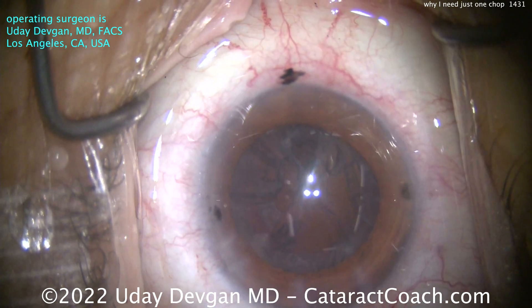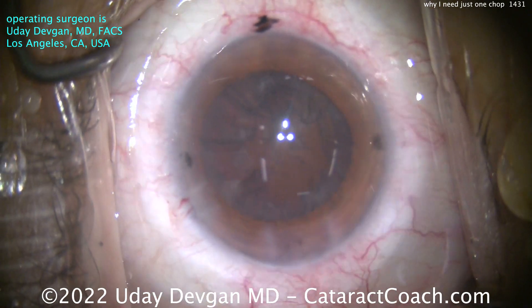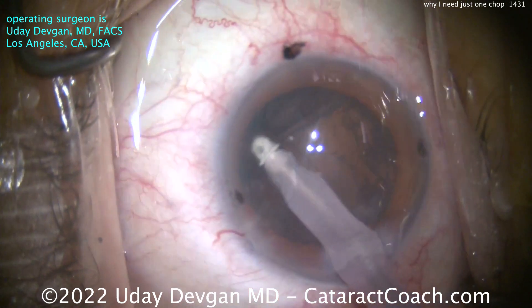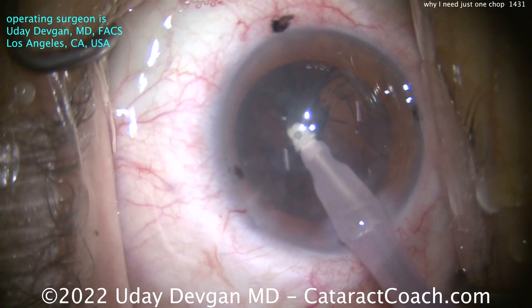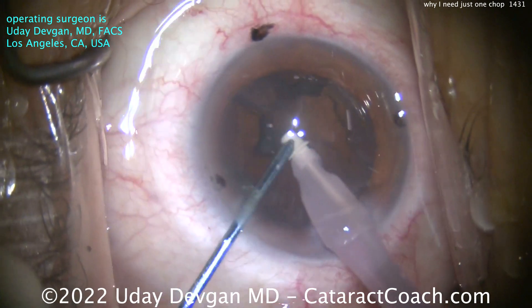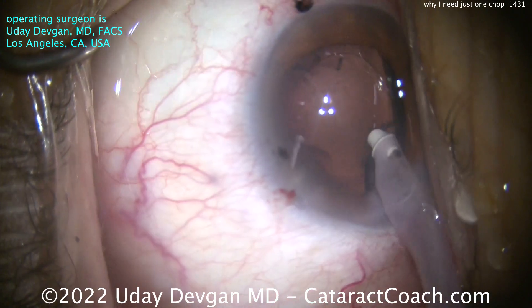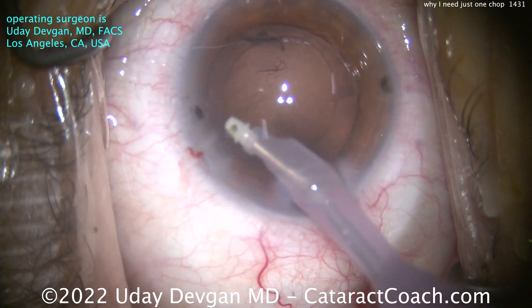The nucleus is out and we're done. So that's the trick behind it: 2-to-3-plus NS — check. Second thing: the rexis has to be 5 millimeters. And third: after that one chop separates the two halves, the chopper pulls one hemi-nucleus piece out of the way to create more of a gap, allowing me to bring up the other hemi-nucleus half using the vacuum of the phaco probe. Once that's gone, it's very easy to remove the other piece and proceed.